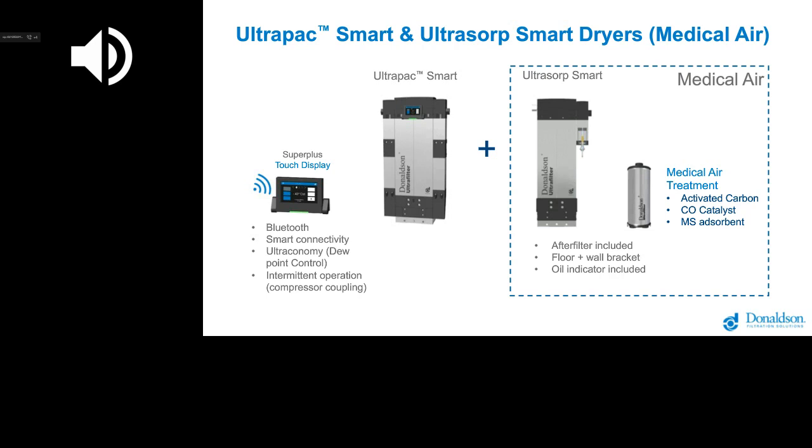It is not foreseen to have that in place as the real air quality measurement, which should be done downstream of the entire purification line by a pharmacist or other people who are allowed to take these quality measurements. But as I said, it's a good indicator in order to quickly check if your adsorbent is in very good condition.